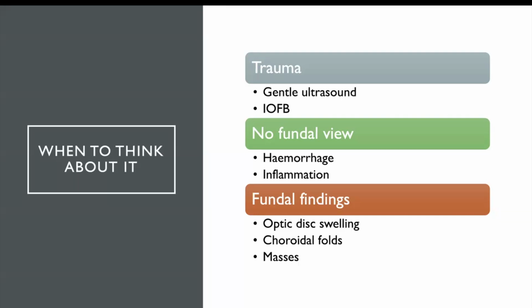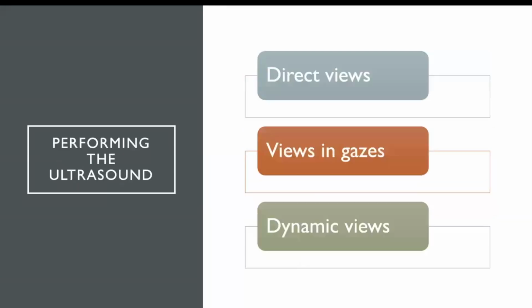And if, for example, you actually see anything within the retina, so if you see a nevus, an actual mass, or something that's elevating the retina, then a B scan can also be helpful. There are formal ocular ultrasounds that you can get, but for your own practice and in clinical care, being able to do an ultrasound is a key skill that helps you sometimes narrow down a diagnosis or at least rule out more serious things in the posterior segment. So how do you do it?